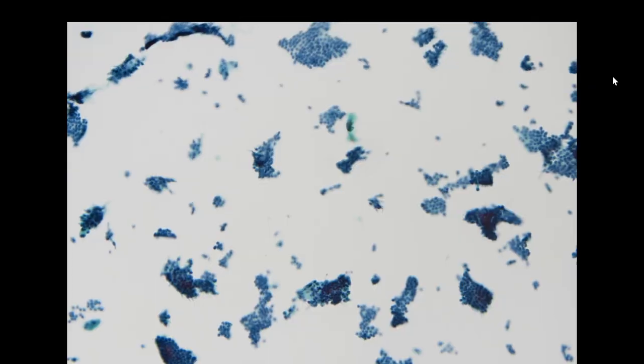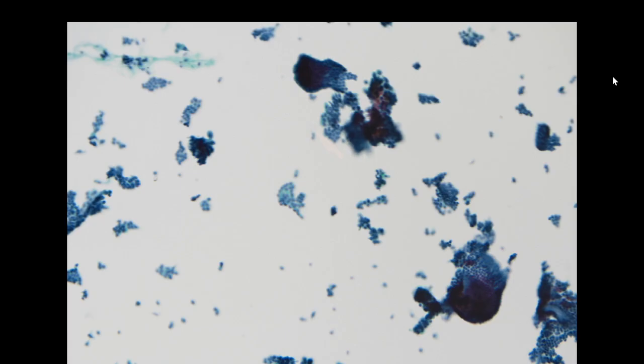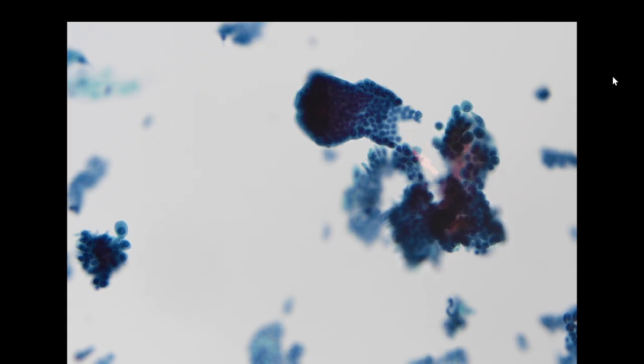For the cellular arrangement, we do see monolayer sheets of cells, as well as more three-dimensional decapitated papillary structures, which are characterized by a luminal border at three aspects, but the fourth aspect is blunted. So this is a decapitated papilla. This is a classic example of papillary thyroid carcinoma, just based on the low power features.